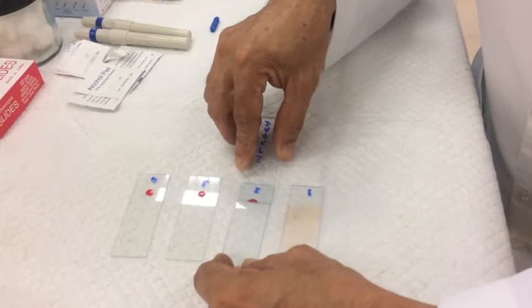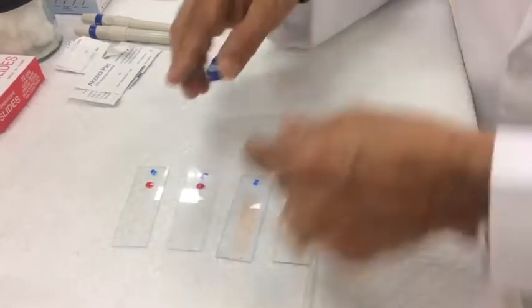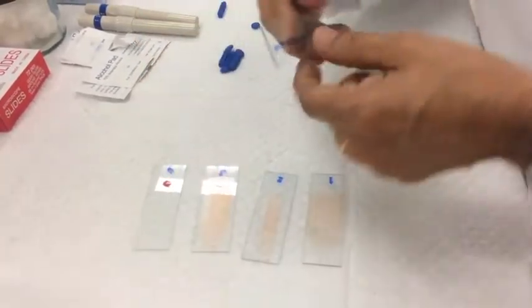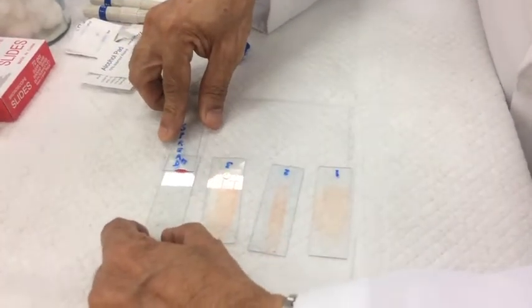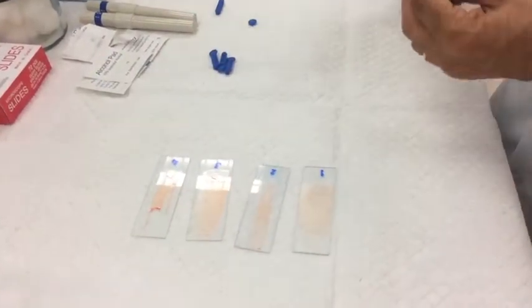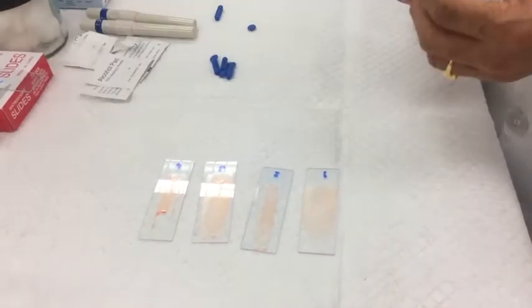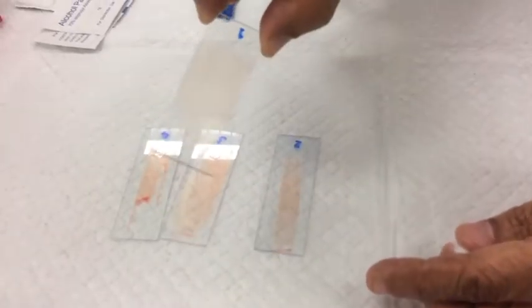Bring the drop of blood and prepare the smear; do the others similarly. This is how you get a set of four slides. This is how the blood smear appears — the wet one looks different from how it will look when it is dry.